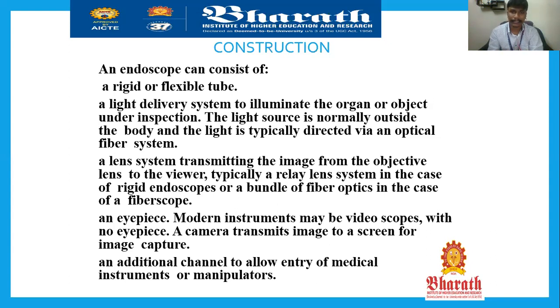So there is no complexity in placing a camera into the human body. The same fiberscope is used, but a camera which records the live internal image is placed after the advancement in technology.